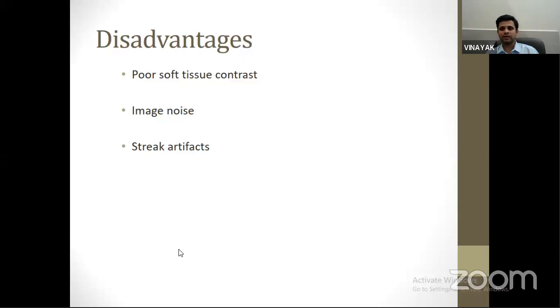So whenever there is metal, like during endo, if there is a GP point present, the radiopacity is seen. If you want to check for a fracture next to it, then you'll have to depend upon the secondary signs, which are a periapical infection, bone loss, complete bone loss, J-shape defect, etc.